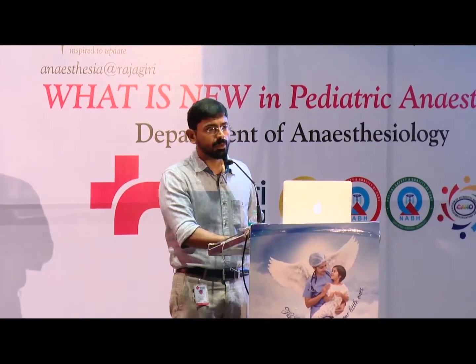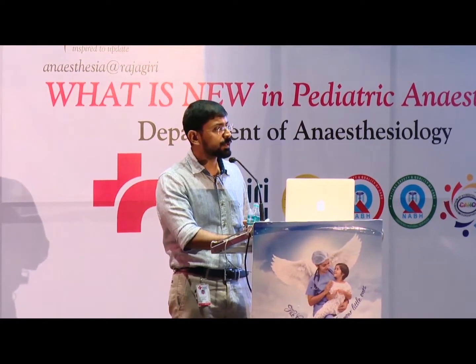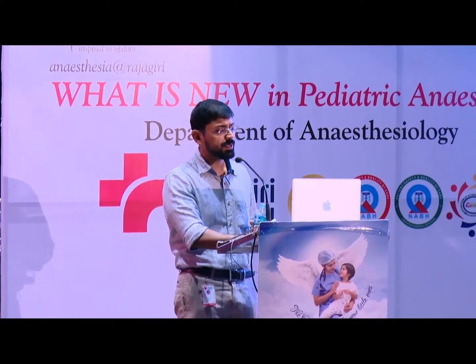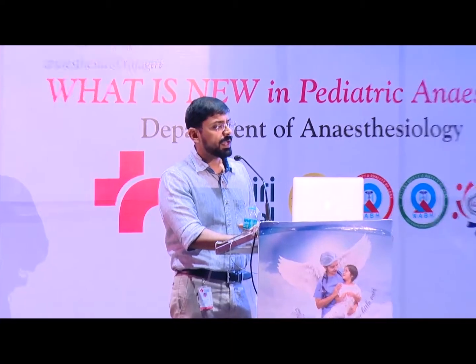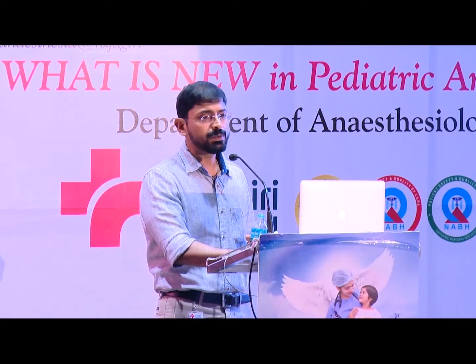So why a size of 2.5 ET tube for this baby? So the appropriate size of ET tube to be used depends on the gestational age and weight of the baby. And at what level is the ET tube to be fixed? The conventional NRP teaching is that the level at which it should be fixed would be adding 6 centimeters to the weight of the baby.